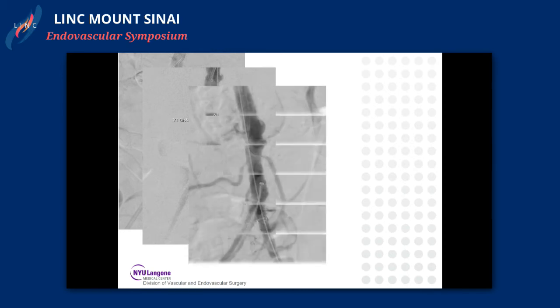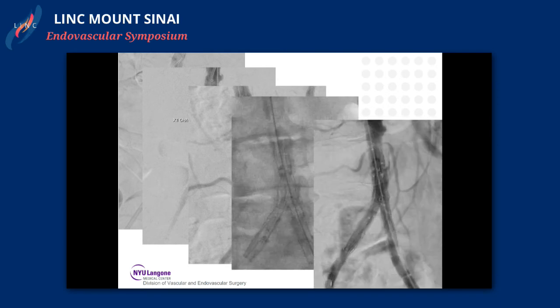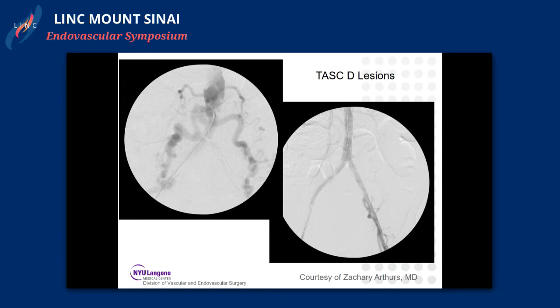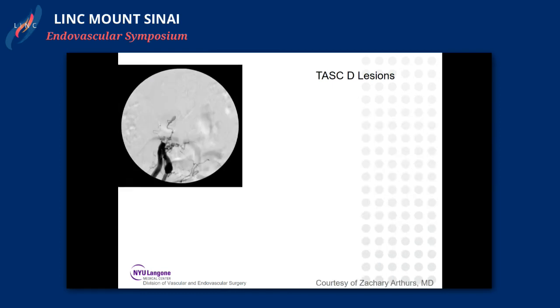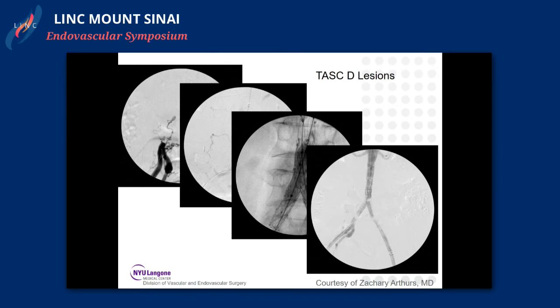There's the 9-millimeter aorta. I protected the IMA — I was concerned about sacrificing it and considered snorkeling it if needed, but we landed just below the IMA. A colleague in Texas, who sees quite a bit of this due to high smoking prevalence, shared a nice technique for TASC-D lesions: he places a femoral-femoral through-wire from one groin to the other, marking the aortic bifurcation. The key is seating the device on the aortic bifurcation to recreate the aorta, with pre-dilatation by balloon to ensure safe delivery. Kissing balloon molding completes the procedure.